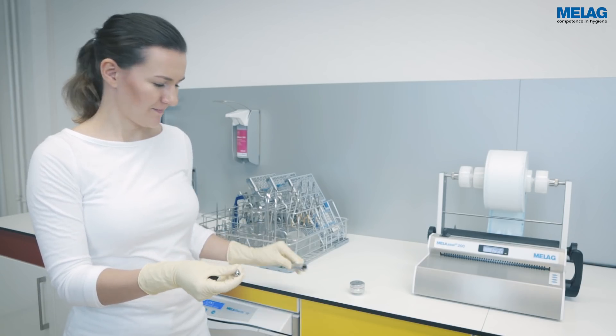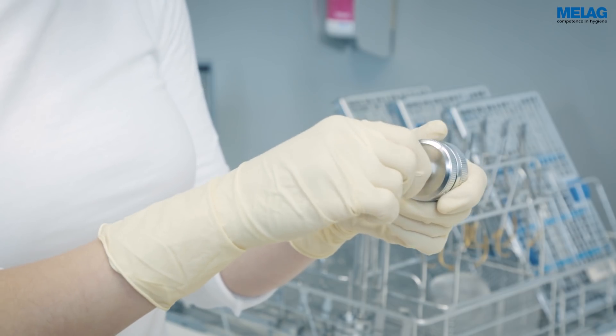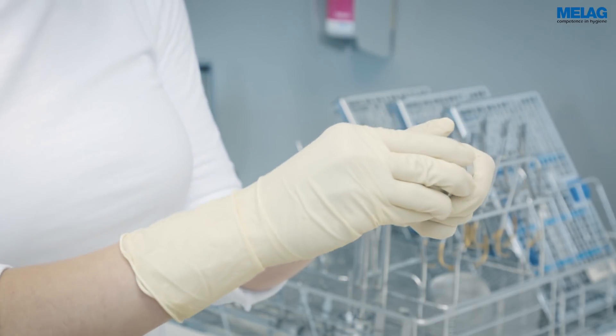Adapters are available for connecting handpieces and ultrasonic scaler tips. A filter disc housing performs the necessary fine filtration of the water.